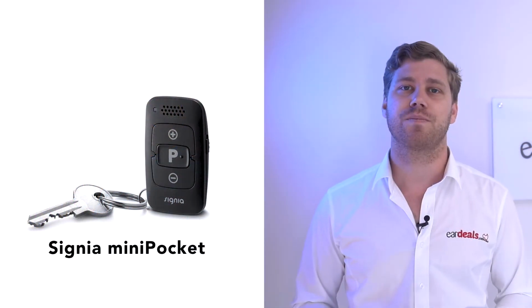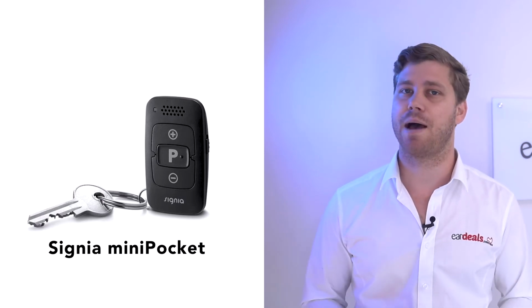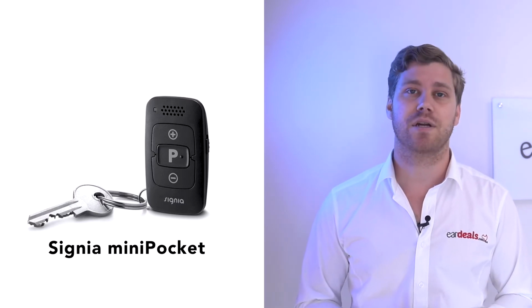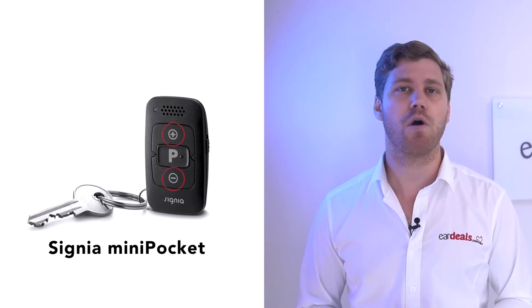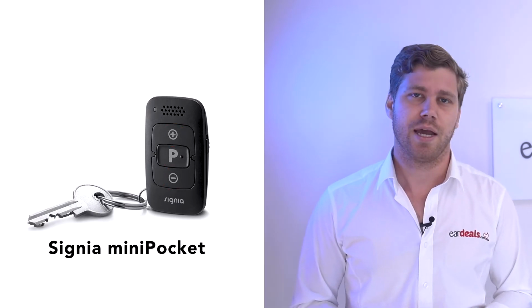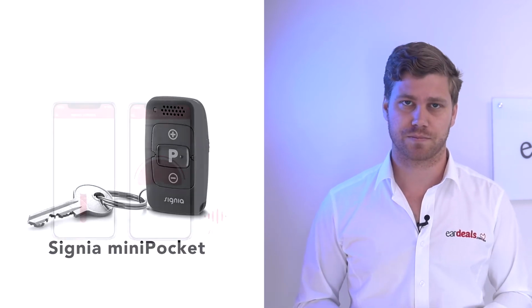The third is the Mini Pocket. Now, the Mini Pocket is very similar to the app in its functionality, but is a little simpler. It has buttons that allow you to change programs and volume and is about the same size as a box of matches. It can be clipped onto your car keys for easy convenience.